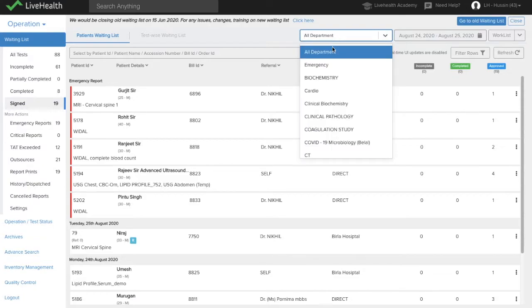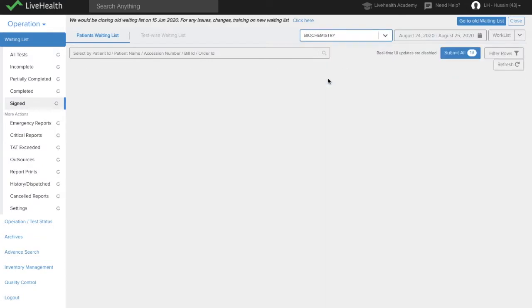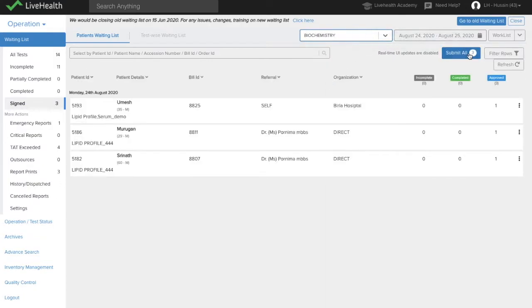For a particular department, you can also use the submit all button to submit all the reports which have been signed for that department.